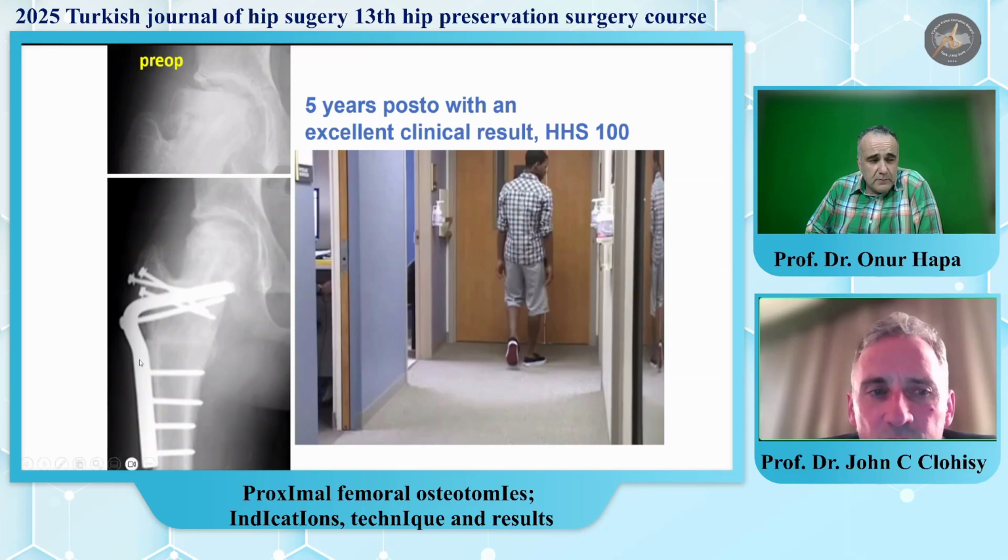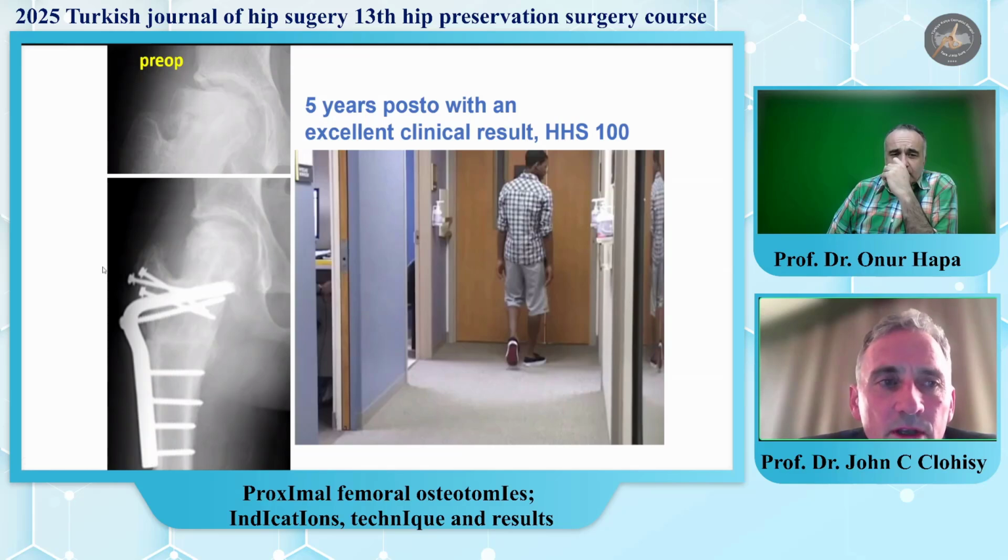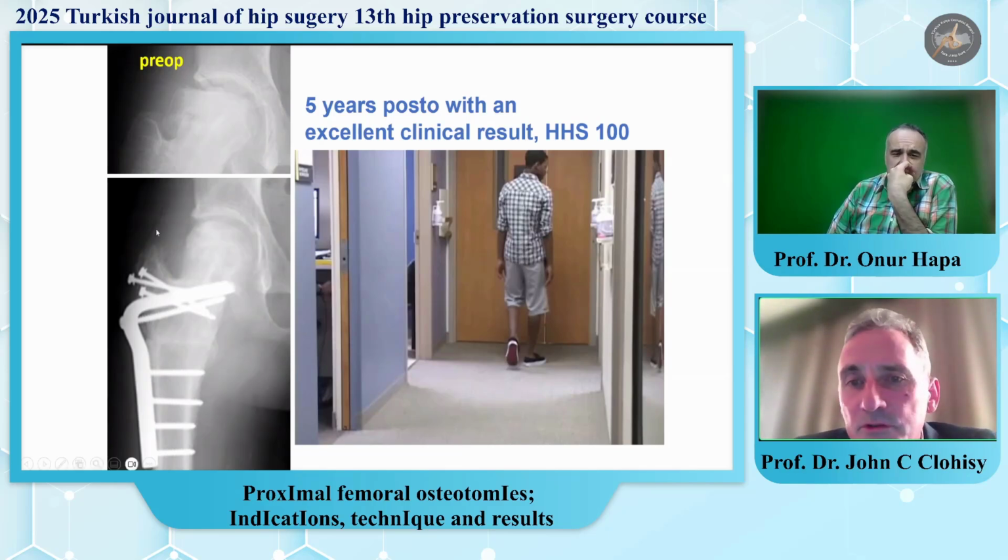That was done through surgical dislocation. So we've done a trochanteric osteotomy, done the work in the joint, did the osteotomy correction, and then reattached the greater trochanter with small frag screws. So that's a more complex osteonecrosis post-traumatic problem, but very powerful solution combining the surgical dislocation with the femoral osteotomy.